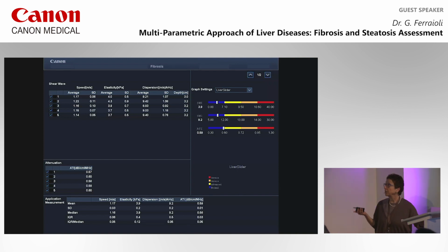And here you can see also a visual assessment of both the shear wave, the dispersion, and the attenuation imaging. For the attenuation imaging, we don't have yet the cutoffs, but we are performing and have concluded a few weeks ago a study. The data are being analyzed.